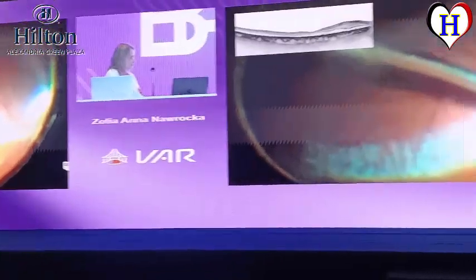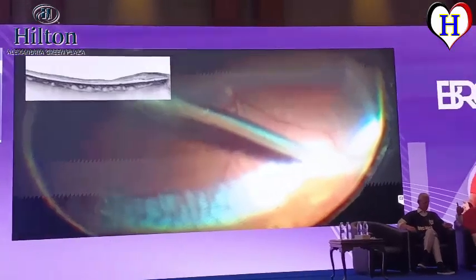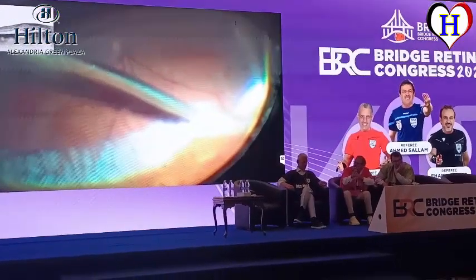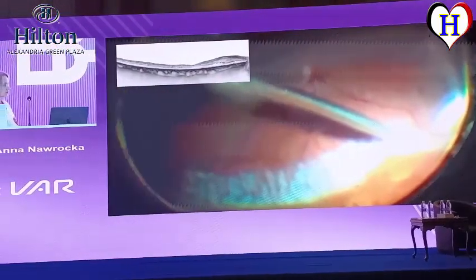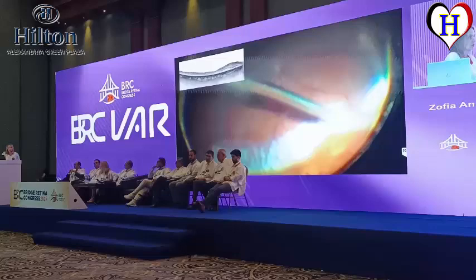So maybe I would increase the bubble of the fluorocarbon a little bit closer to the tail before attempting doing this. Third point is I never cut in the periphery where I can't see well. If I'm too peripheral like this, maybe I will do a little bit of indentation so the tissue comes into the center of the lens so I can see where I'm cutting. But I think it happened mainly from the lower part of the scissor. It hit the choroid in that area. At the end, you see it coming from the choroid or the retina. Completely agree. It might be the reason.